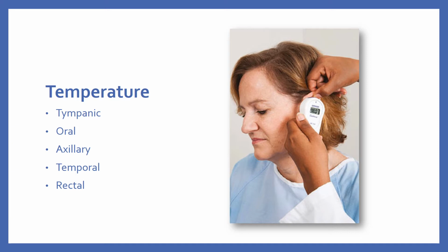To measure oral temperature, use the electronic thermometer with the disposable protective probe cover. Then place the thermometer under the client's tongue to the right or the left of the frenulum, deep in the posterior sublingual pocket. Ask your client to close his or her lips around the probe. You want to hold the probe until you hear a beep with a digital read, which is about 10 seconds or less. Read the probe and dispose of its cover by pressing the release button. The oral temperature range is 35.9 to 37.5 degrees Celsius, or 96.6 to 99.5 degrees Fahrenheit.